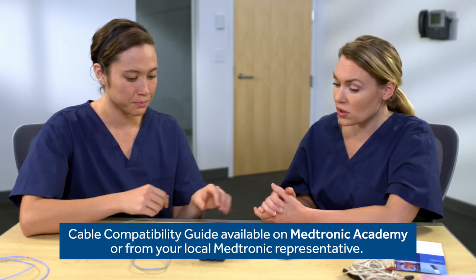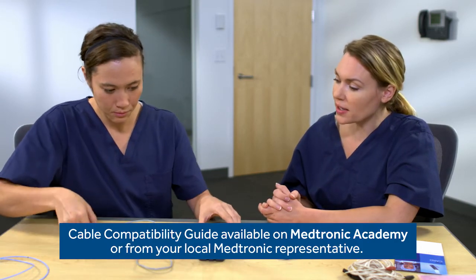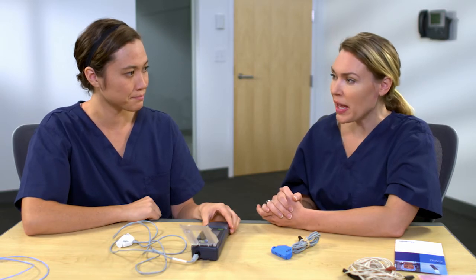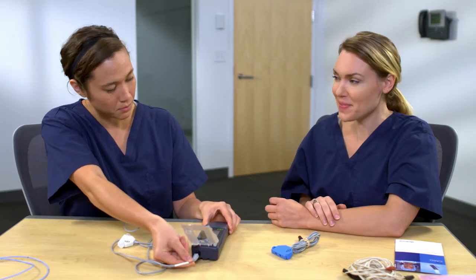First, make sure the device is turned off. Then plug the cable into the cable socket. I heard it click. Yes, you want to make sure you hear the cable click into place. You'll also want to pull gently on the cable to make sure there's a good connection. Like this? Yep, exactly.